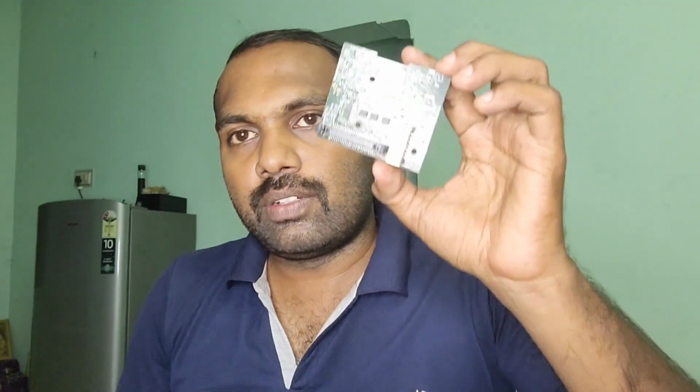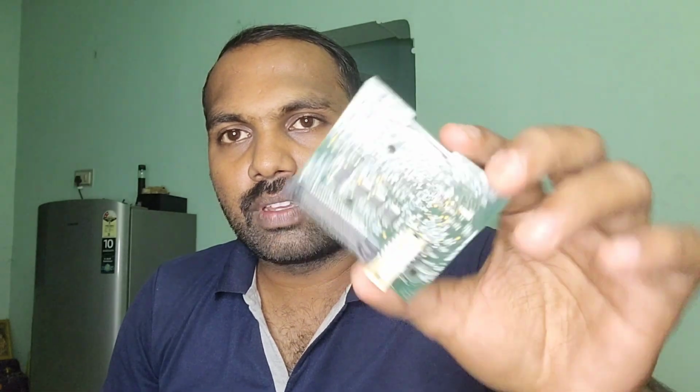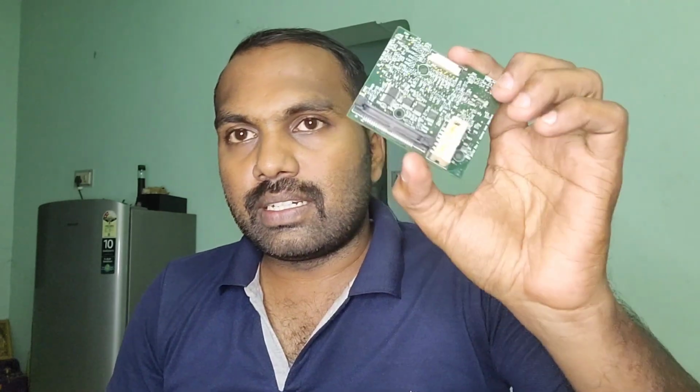Here we have a board which is coming from Telangana, and this is a pulse oximeter board. I don't know which pulse oximeter this is. They said they cross-checked with another machine and found the problem is here.